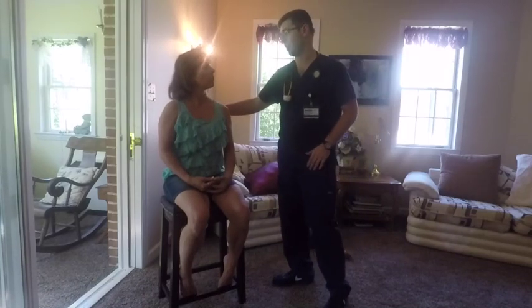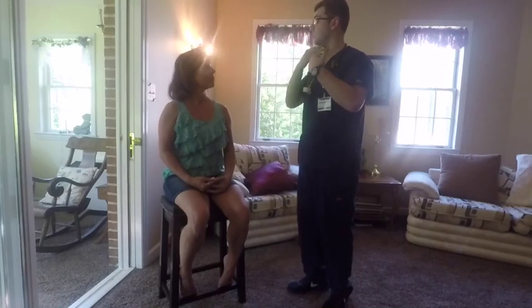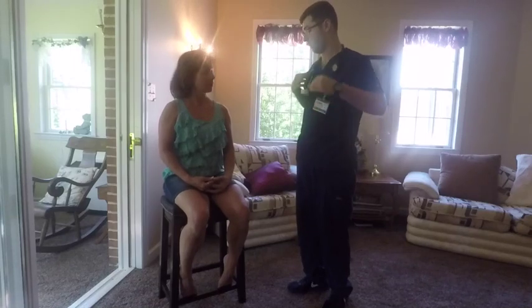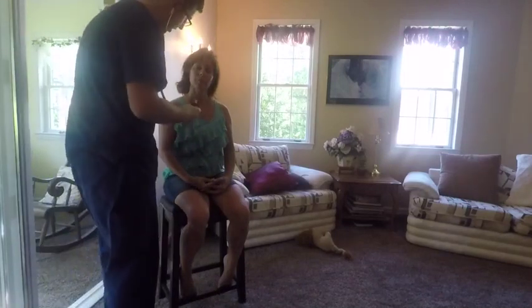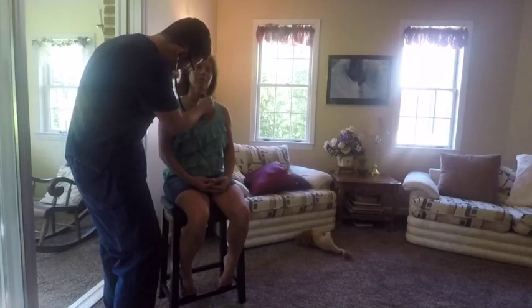There are bronchiovesicular noises in the back that I can hear, but just for this assessment, I'm just going to listen to the bronchiovesicular in the front, and then vesicular in all other areas, okay? So I'm going to start with the front here. If you can just take a nice deep breath for me. Very good, and again. And one more time.